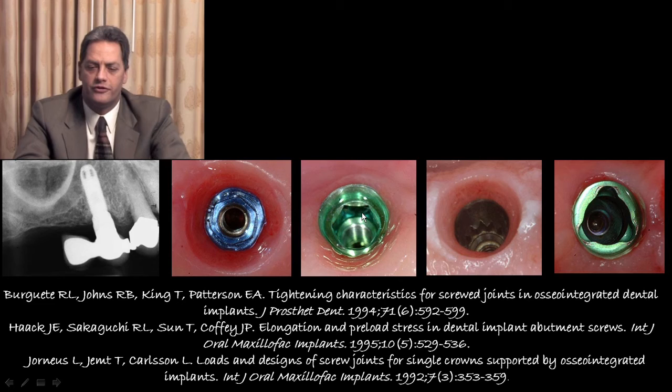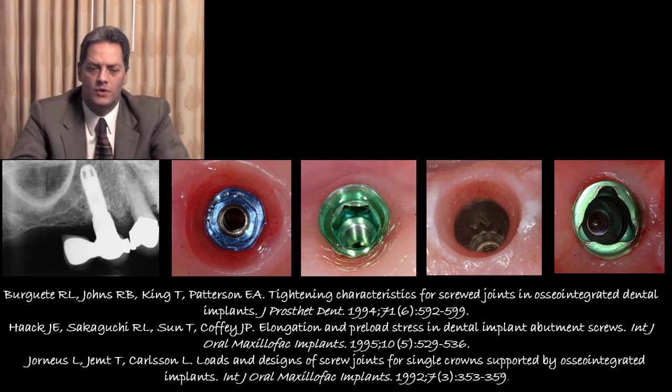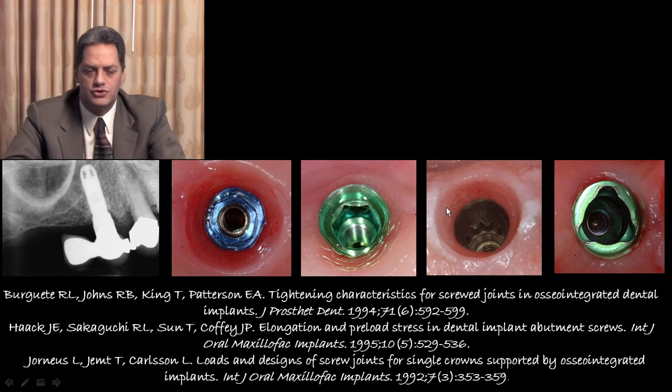And the tolerances that are created by these companies have been so superior that we don't see much loosening of the screws anymore. What's very important is that we also see a healthy environment around the implant. So the soft tissue healing and profile is very critical for a long-term healthy result.